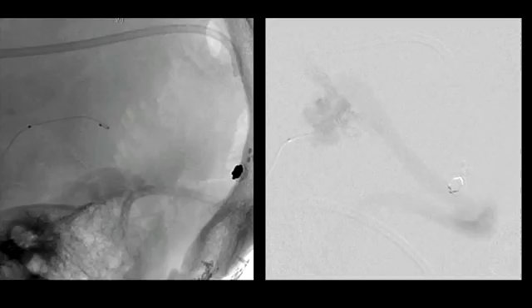These are working projections, oblique, where you can see the microcatheter, which is a Headway Duo microcatheter, is traveling from the P-com P1 segment to the artery of Davidoff and Schechter, all the way distally into the meningeal branch feeding the fistula. And this is a lateral projection showing the same thing, where you can see filling of the fistula pocket and then draining into the straight sinus.